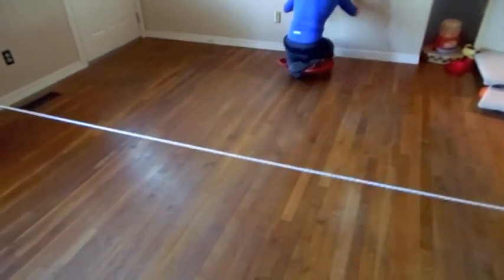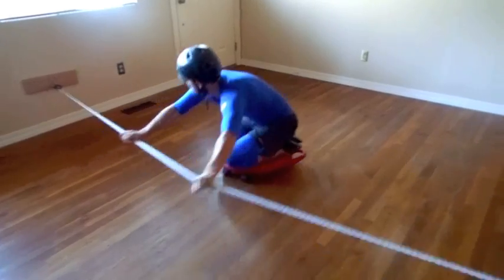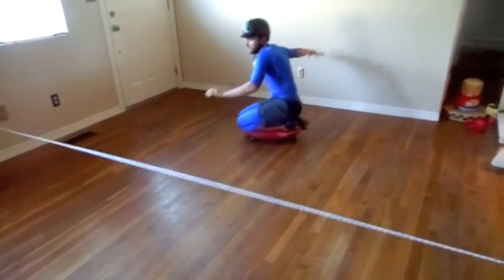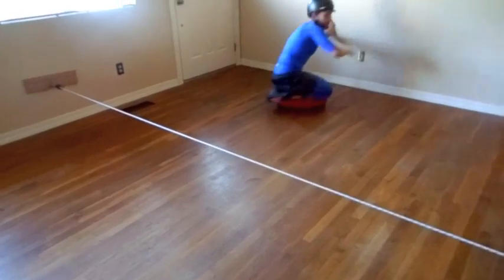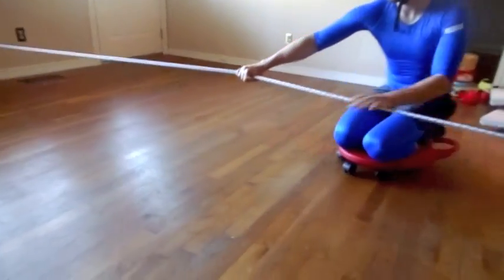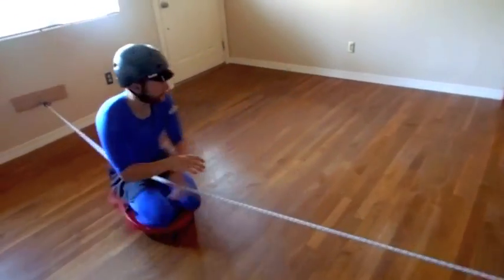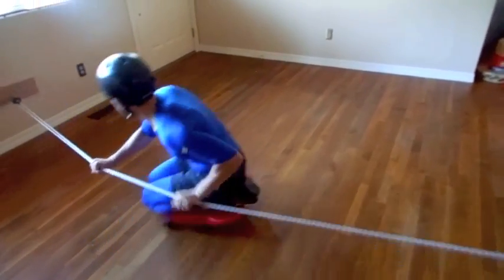The Freestyle Challenge. The therapist will put on upbeat music or the child's favorite music to use for creative movement while on the scooter board. As you can see, Alex is using multiple walls, multiple rotations, and creating as he goes. Notice that this activity requires high-level balance and should not be tried in the beginning stages of a scooter board bungee program. Be careful and remove all objects. Have fun, but be safe while doing it.